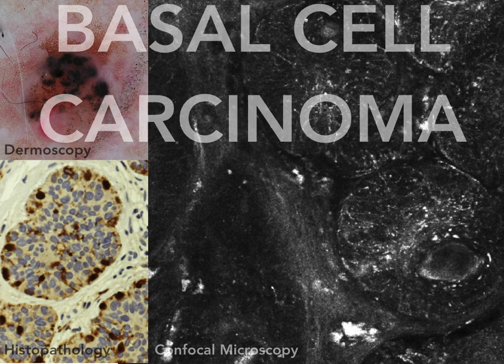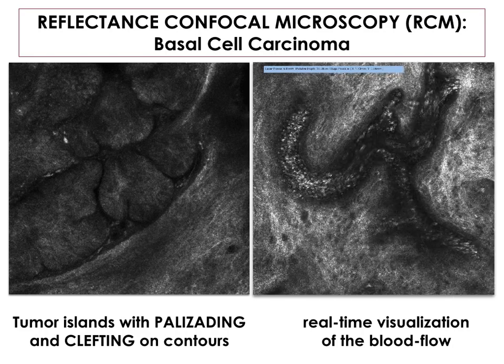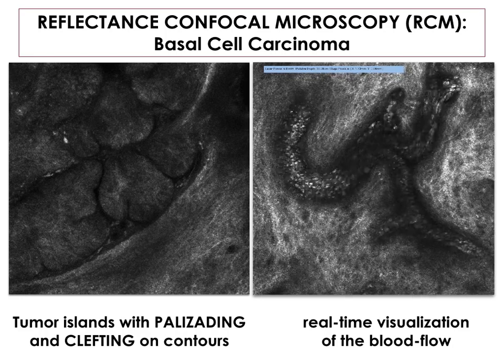Concerning basal cell carcinoma, confocal microscopy is able to show tumor islands characterized by peripheral clefts. In this image, tumor islands are easily detectable, characterized by palisading and the peripheral cleft. Also, enlarged blood vessels can be visible, especially during live imaging with blood flowing inside.